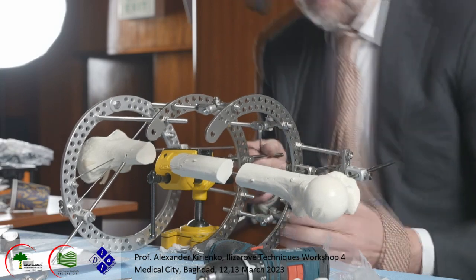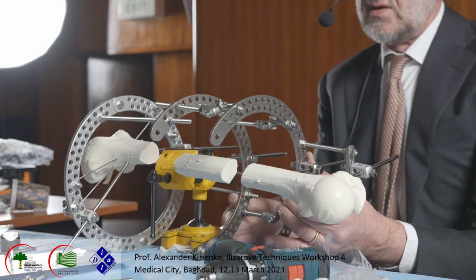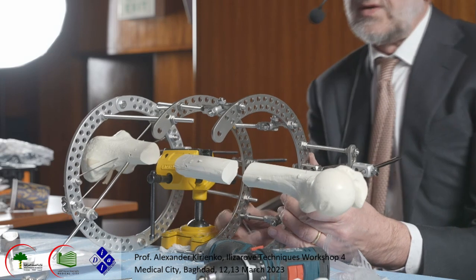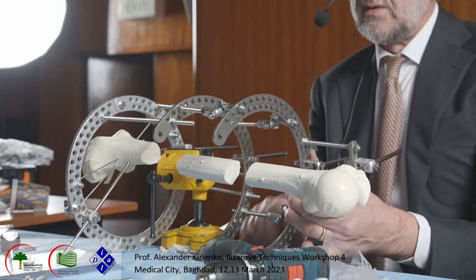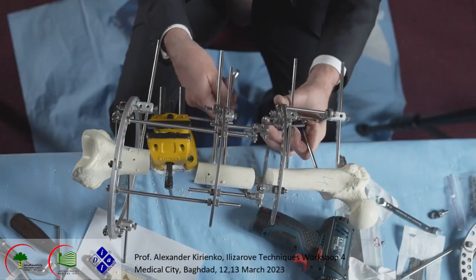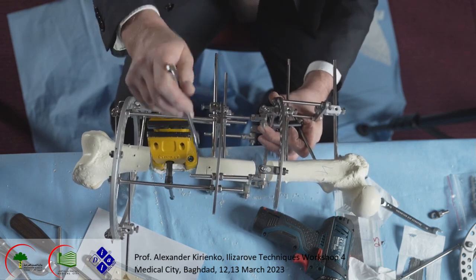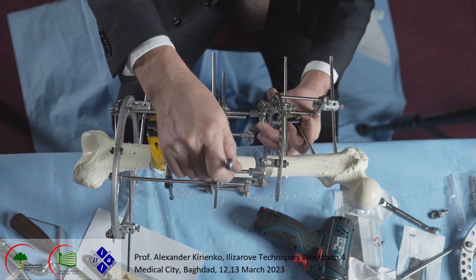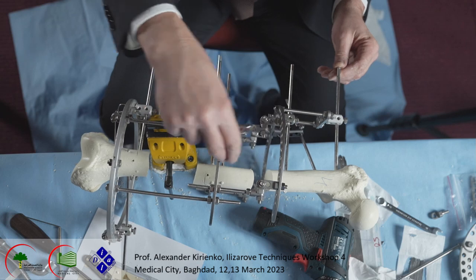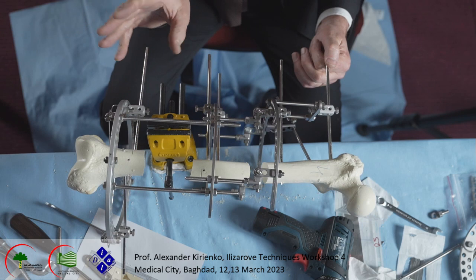All the corrections should be done slowly or maybe quite acutely, because if the regenerate is elastic, plastic, like rubber, you may achieve it quite immediately. Or if you prefer, you may do it over a few days. And this way you control the correction of procurvatum. Okay, only with your hand. We continue lengthening proximally, compression distally, and you achieve the healing of the bone.